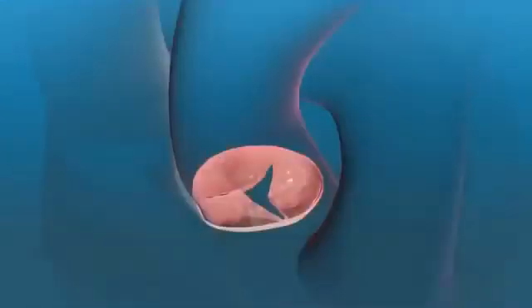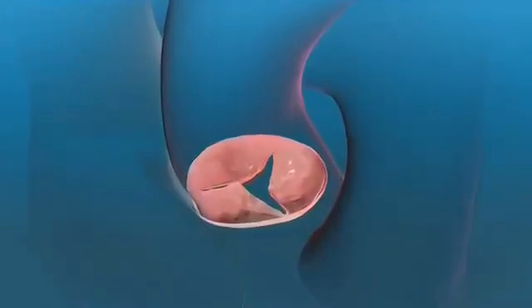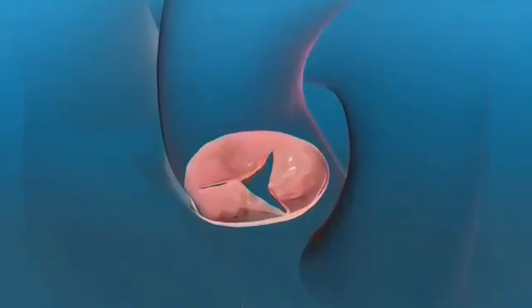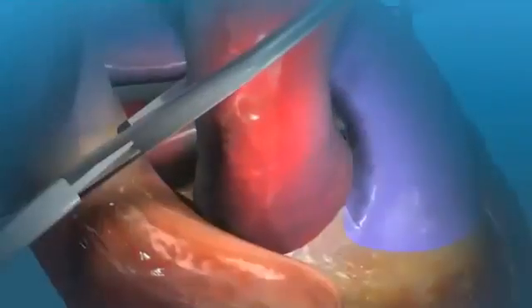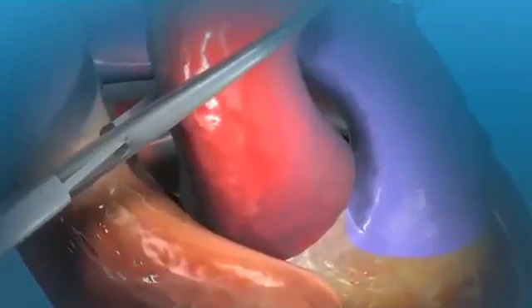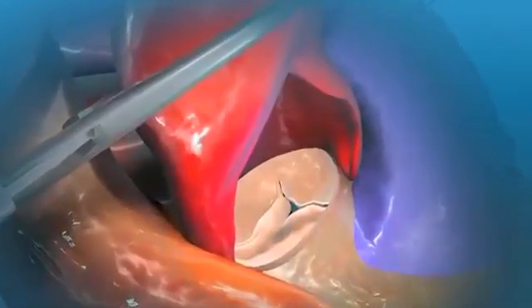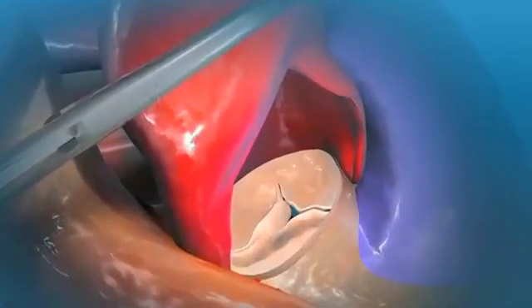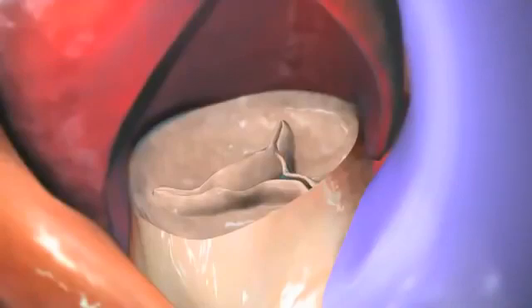This keeps the aortic valve still and allows your surgeon to see it. Your surgeon will open the aorta to expose the aortic valve, make an incision around the edge of the damaged valve, and remove it.